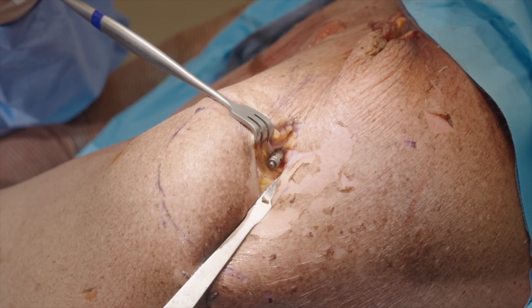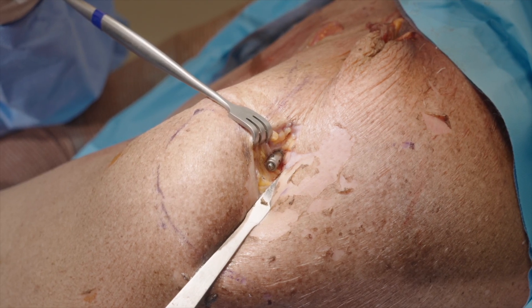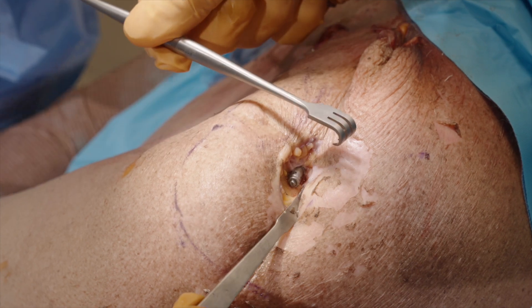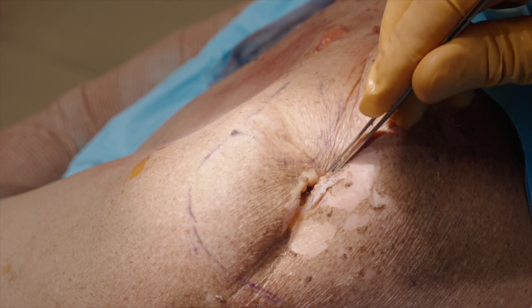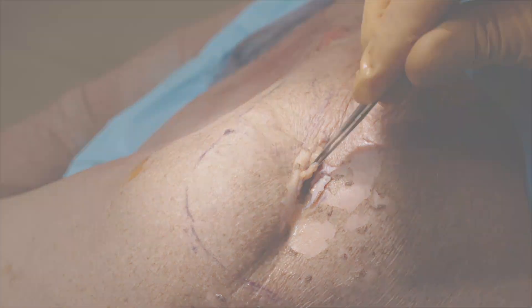Irrigate the surgical field. Close the trapezius insertion over the extracortical part of the Anser clavicle pin to reduce the chance of hardware prominence. Close the incisions. Apply dressings and place the arm in a sling.